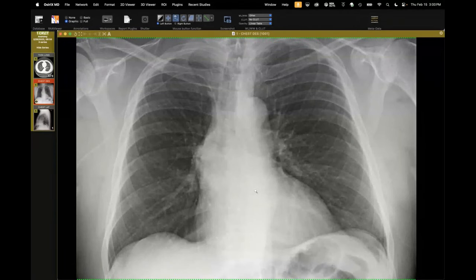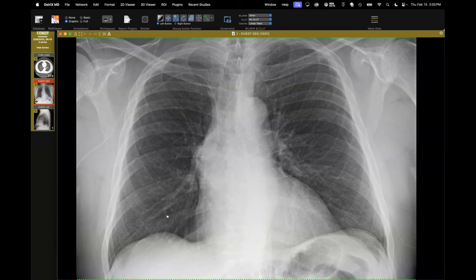We see accessory fissures all the time. Sometimes you can pick up an inferior accessory fissure on a lateral radiograph, and on a frontal sometimes a superior accessory fissure. But this patient has one of the most robust horizontal fissures on the left I've ever seen — I've seen it once before on imaging and on CT often, but never quite like this on a radiograph.